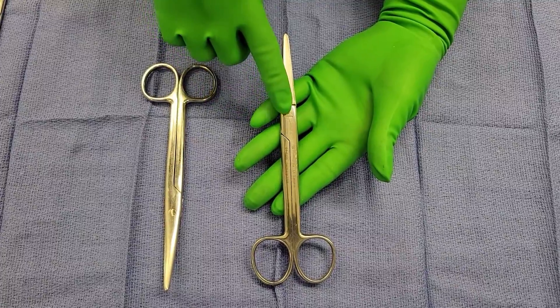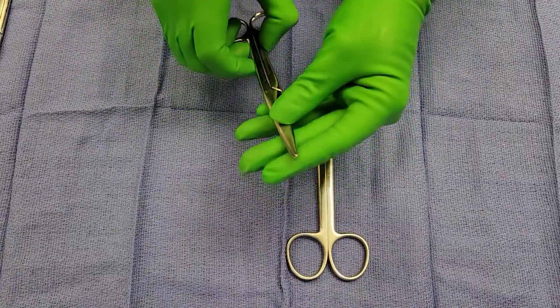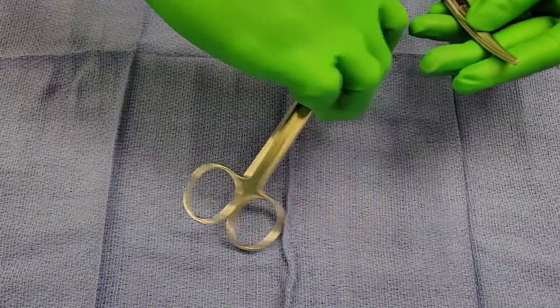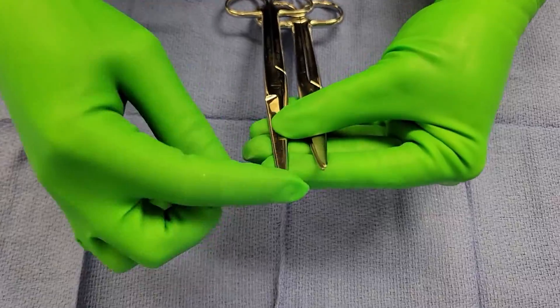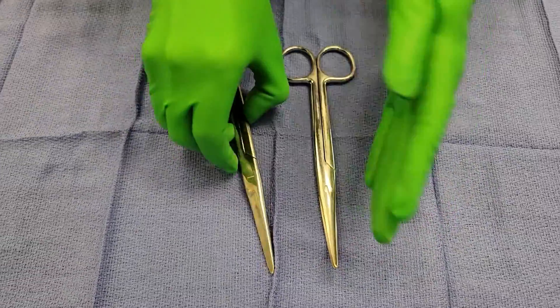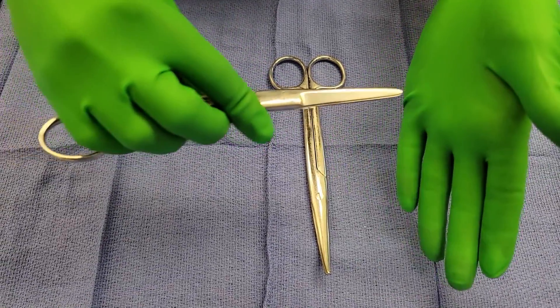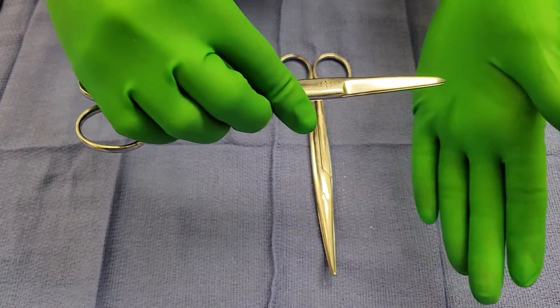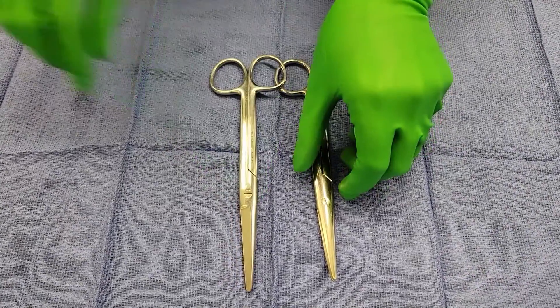It's kind of like a utility scissor — you can cut dressings, Steri-Strips, or suture with the straight one. One thing to notice is that these are characteristic for having a blunted tip, so they're relatively safe to use because they won't penetrate tissue and cause tearing.